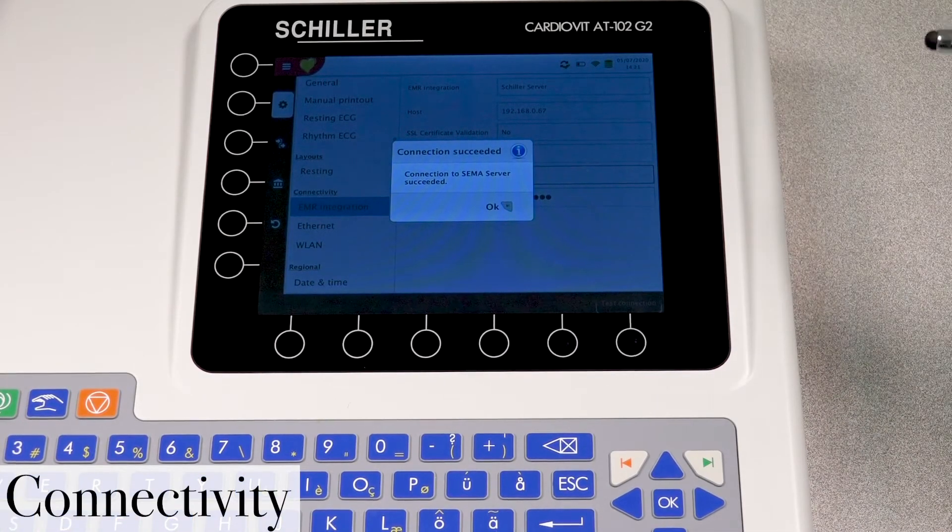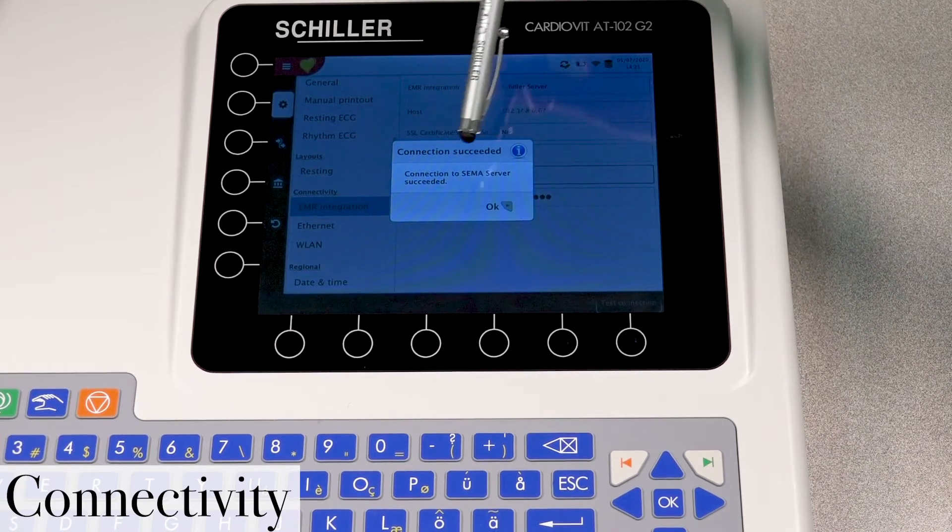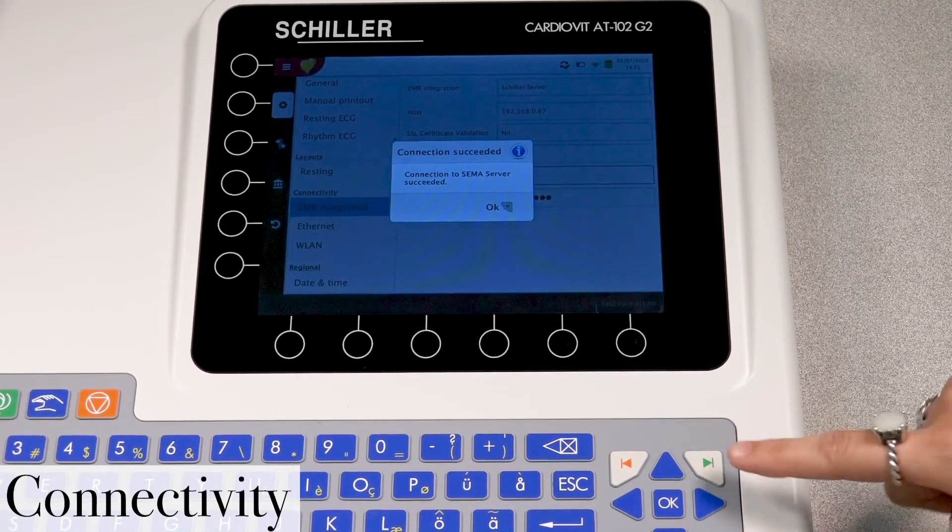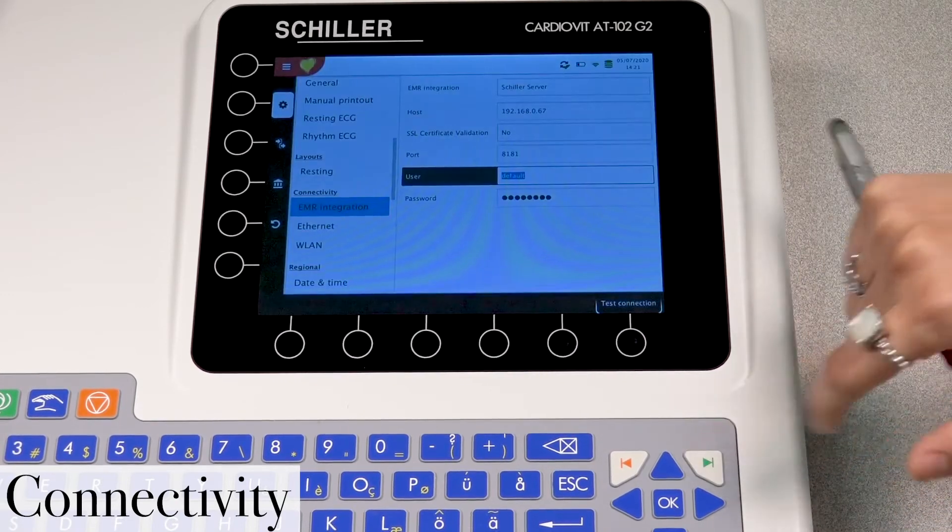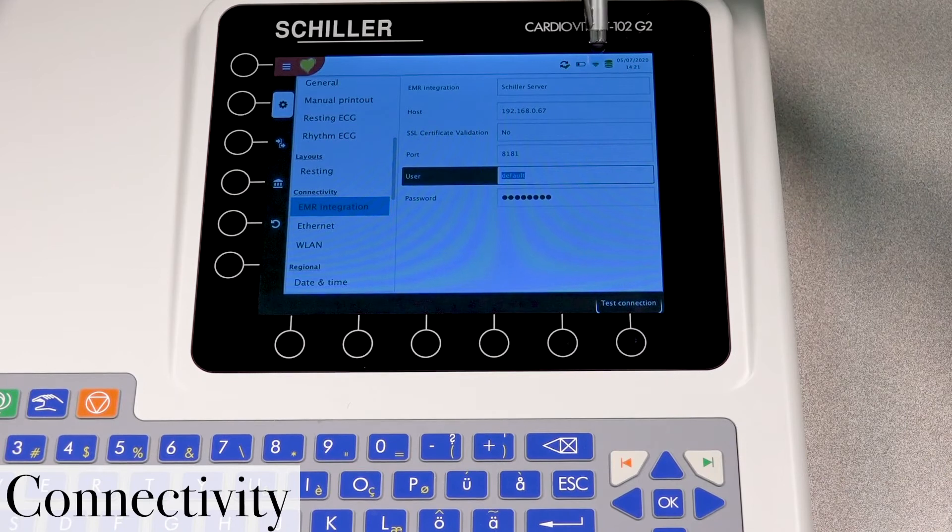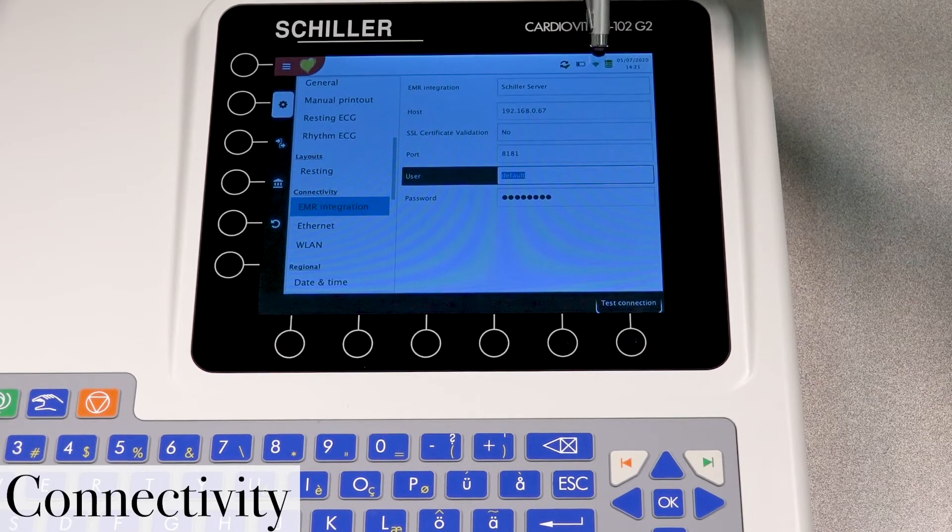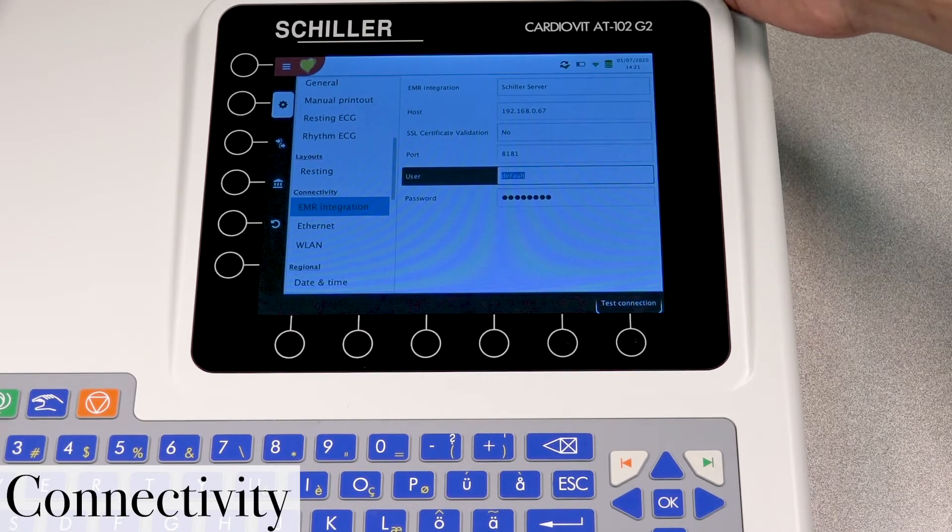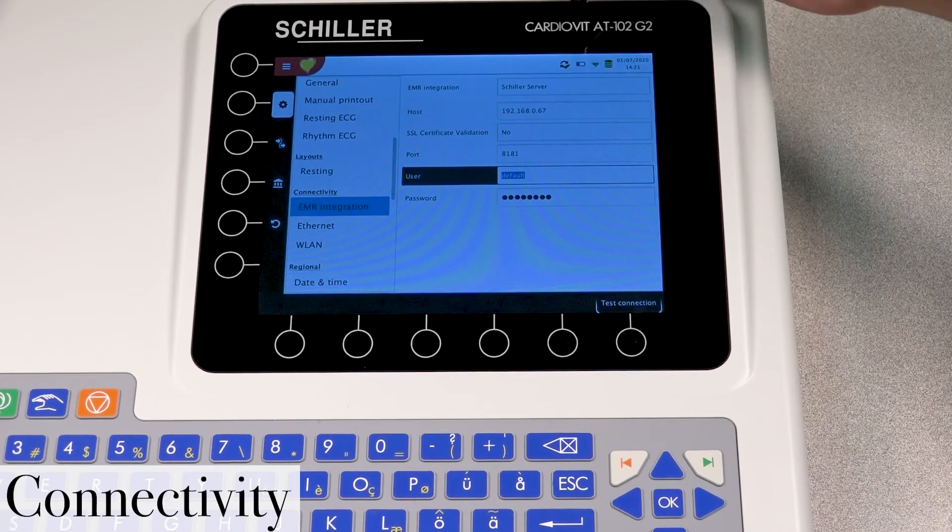And then you would get a message indicating that you have successfully connected to the server. We're going to go ahead and press OK by pressing this green button here. And if you notice now your black Wi-Fi icon has now converted from black to green. And when you have a green Wi-Fi icon, that indicates that you are now connected to both Wi-Fi network and the server.